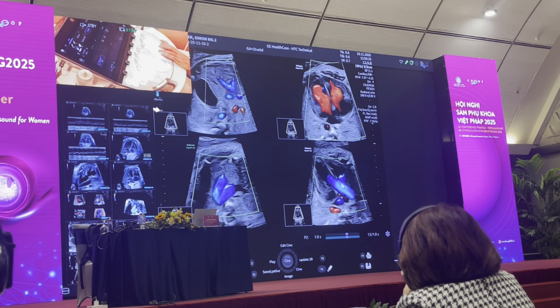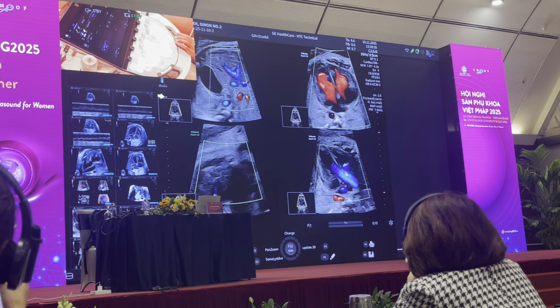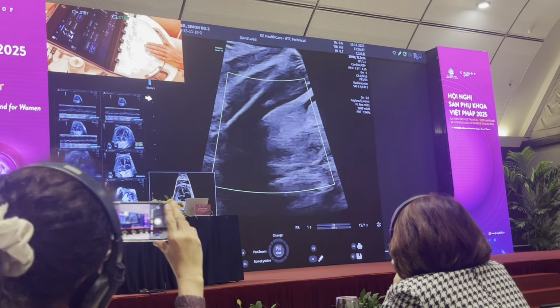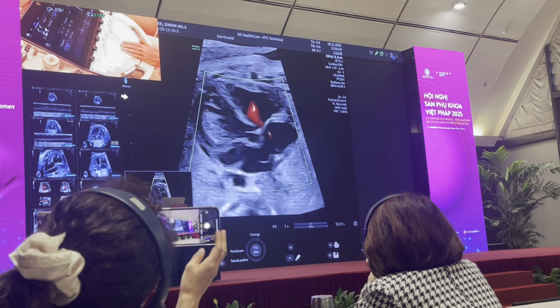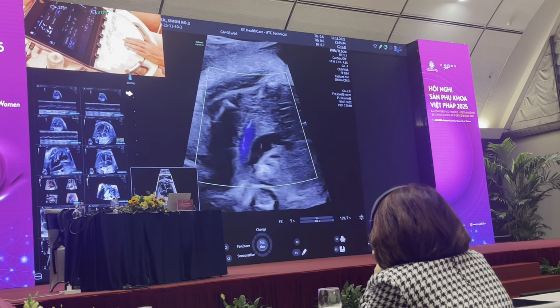The only problem the baby has is an intermittent rhythm disturbance, which I'm not too worried about, but I would involve a pediatric cardiologist. In a baby who's got a cardiac disturbance, it's important just to make sure that there's not any evidence of hydrops.